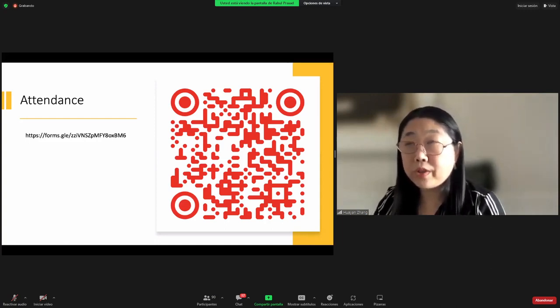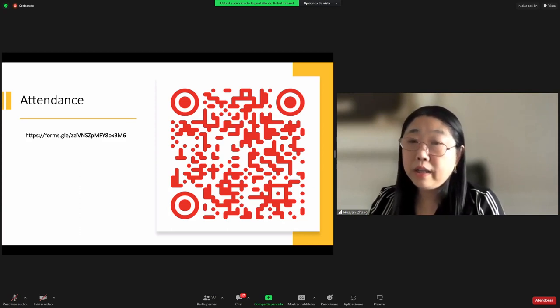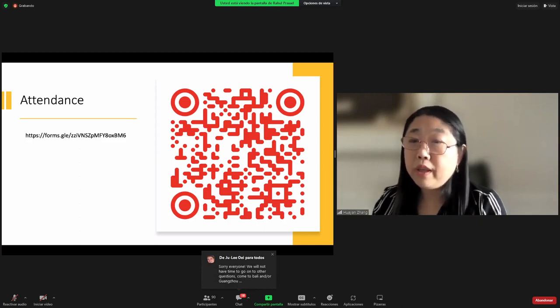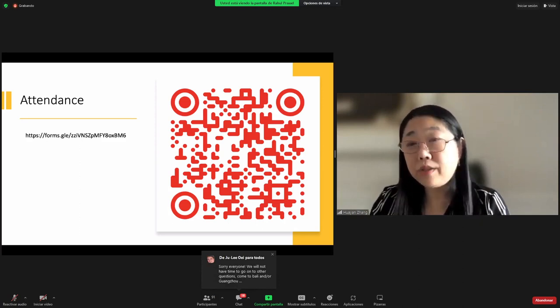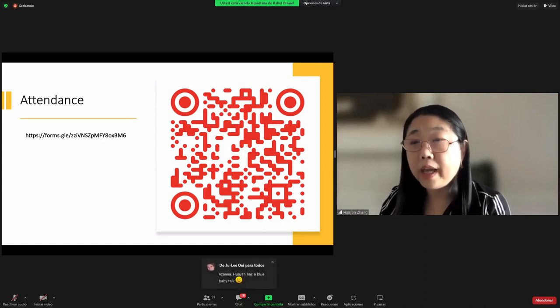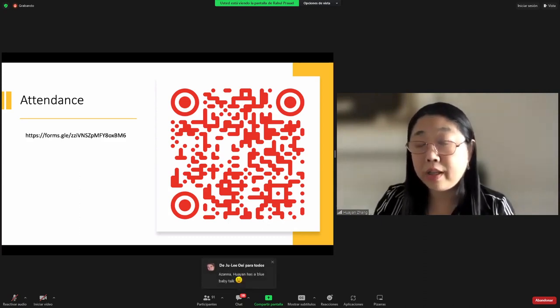In terms of pressure support breaths, in the early days of RDS, we generally use a pressure support that achieves slightly lower overall pressure or tidal volume than the SIMV breaths, because you don't want to give too much support and you want them to come off ventilation as soon as they can, right? So we can use that strategy initially, but if they don't do well, we adjust.